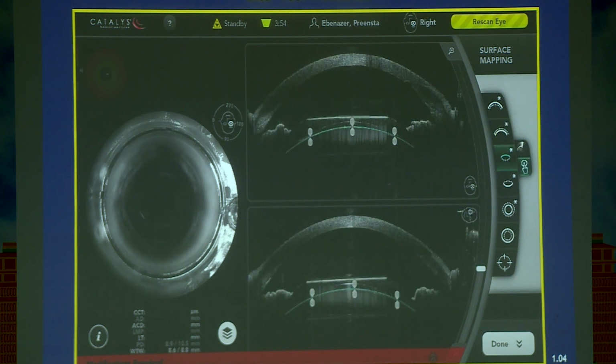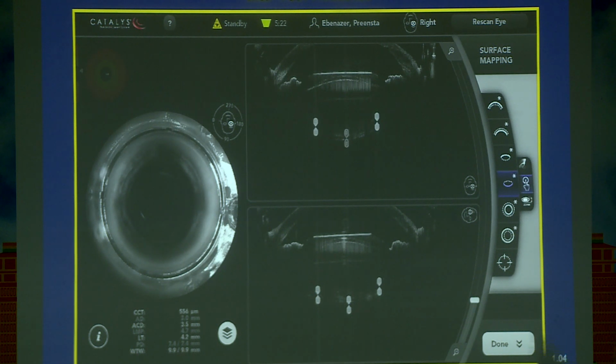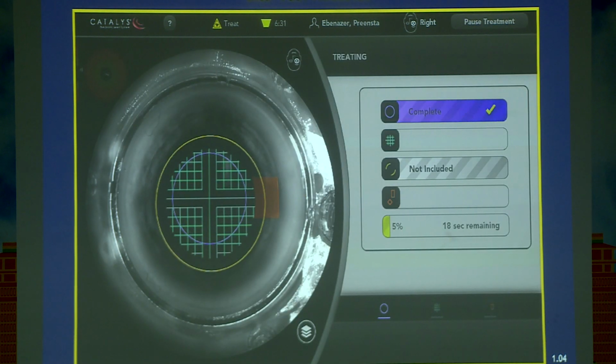It's also possible to use a laser platform even in the presence of a phakic intraocular lens, especially because there's a significant anterior subcapsular fibrosis. If you can use the laser, then you get an adequate rhexis, and you are able to exactly titrate the position of the treatment in such a way that it overlaps onto the anterior lens surface, creating a rhexis. I'm going to skip this. Go forward a little bit.